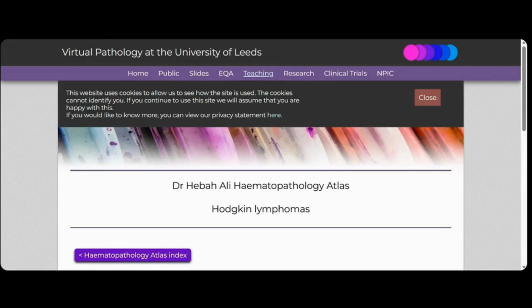So most lymph nodes that we see are in fact non-neoplastic. And of course we focus on neoplastic things, but it's important to see some of the non-neoplastic diseases. And of course in the British Lymphoma Pathology EQA that we have gone through in the last few months, there have been reactive cases in that. And I think the difficulty of distinguishing reactive from neoplastic lymphomas is very well recognized in the UK. That's why all lymphomas have to be diagnosed in specialist centres, because otherwise there is an error rate of 15%, which is 1 in 8 patients getting the wrong diagnosis.